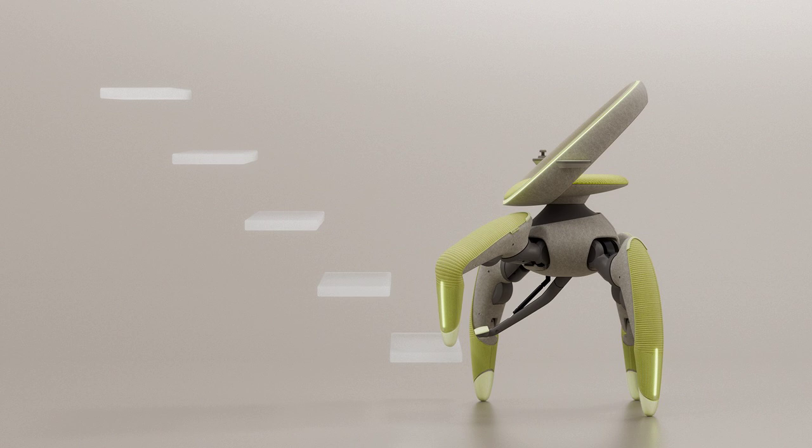Weight Stabilization: Sensors constantly monitor the user's weight distribution, and the chair adjusts leg positioning and seat tilt to maintain stability and comfort.